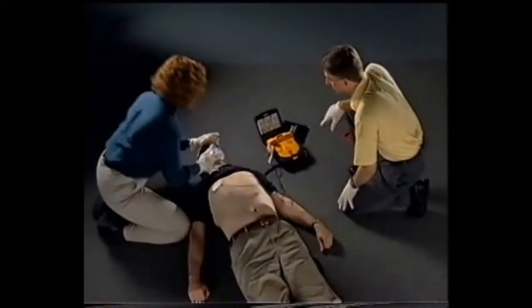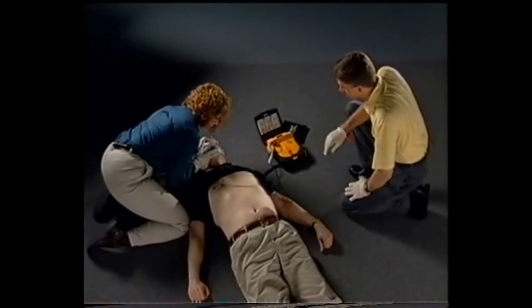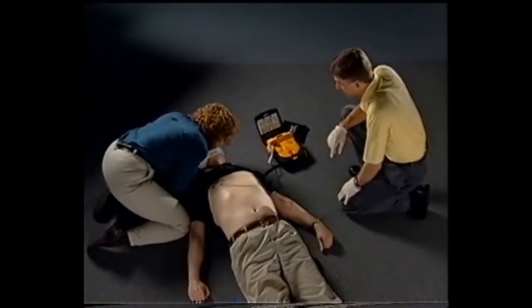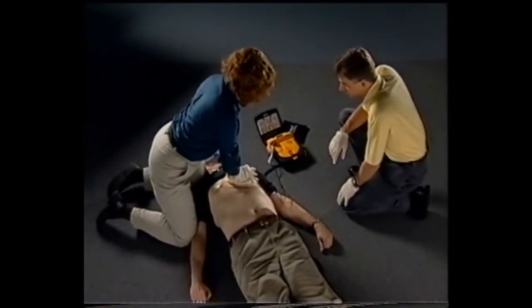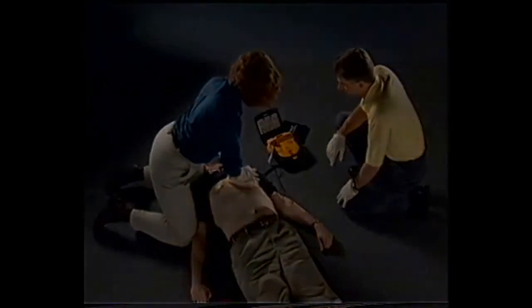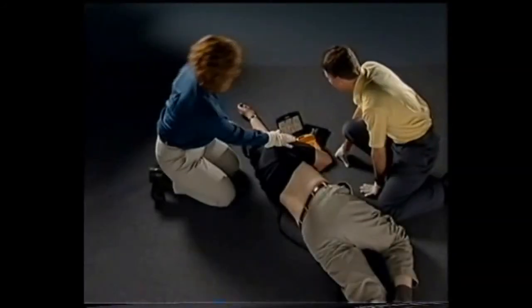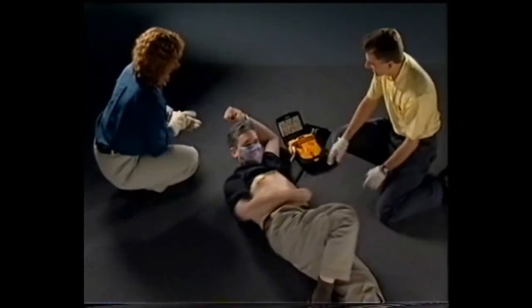If you hear the defibrillator say, "Call service," it means that the defibrillator has detected a problem that prevents its continued use. You should continue to treat the patient according to your training until emergency medical personnel arrive. Obtain another defibrillator if possible. This is the end of part 1 of the video. You have learned the simple steps that enable you to help save a life.